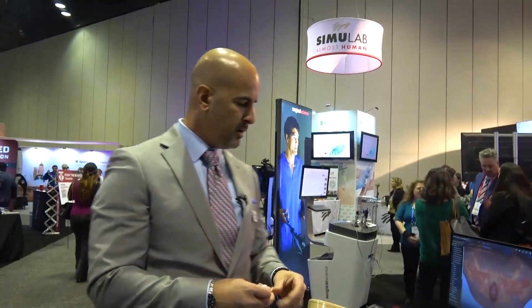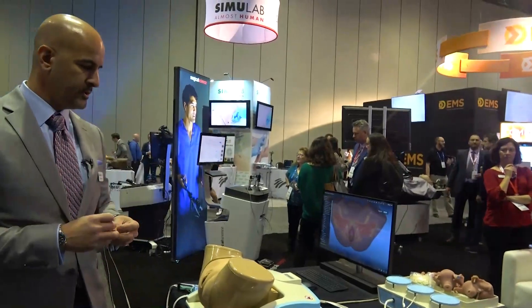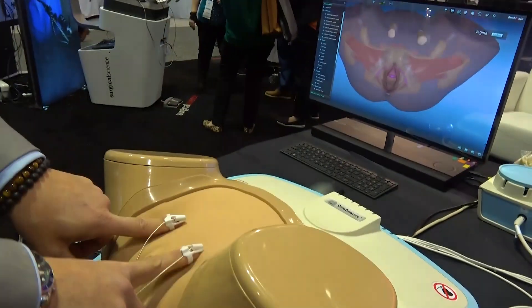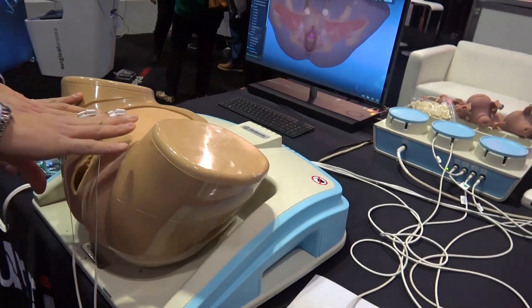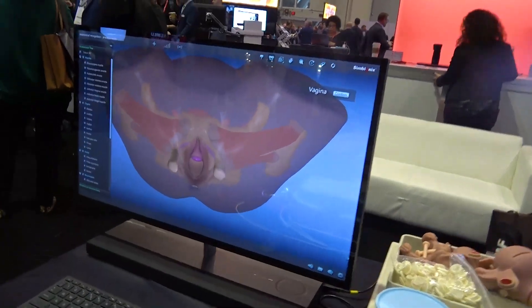This simulator is our Pelvic Mentor — the only hybrid simulator here, combining a physical mannequin with virtual reality. Users can perform a pelvic examination using finger sensors, which are visible on screen. This is a blind procedure, making it a very difficult skill to acquire because practitioners cannot see what they are touching.